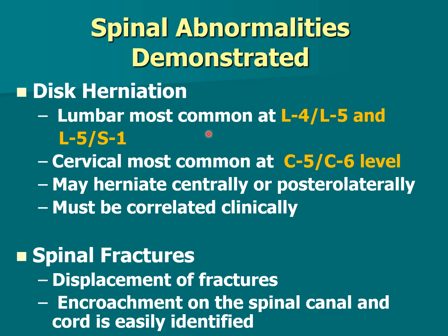You correlate your findings with the clinical symptoms the patient has. Like I say, I have a pinched nerve in my neck. Before I had the MRI, the doctor, from me telling him where on my thumb it was numb, could tell me exactly already, without scanning, where my nerve was being pinched. Now, to see how much he needed to scan, but clinically he had to match it up.